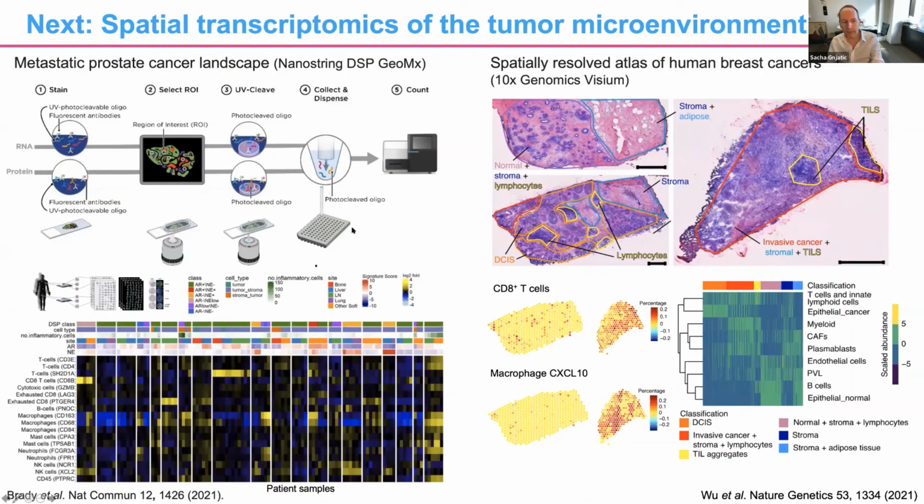methodologies for the analysis of tissues, and one of the hot topics this year has been spatial transcriptomics, and it's a very in-development technology which will probably change a lot in the coming year. But there are 2 platforms that have been looked at the most probably, which include the NanoString GeoMX platform as well as the 10x Genomics Visium platform, and we're currently doing some QC for looking at how these methods compare to each other, as well as what type of pre-analytical variables are required to make sure that these tissues are well analyzed.